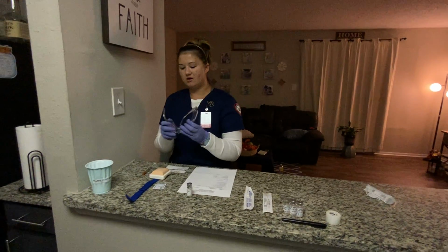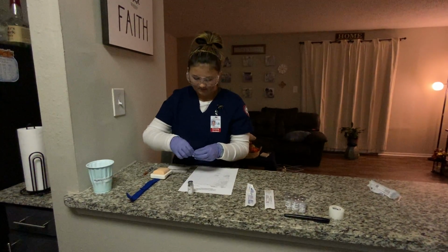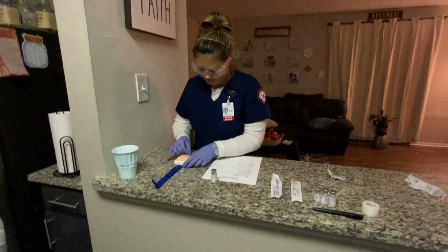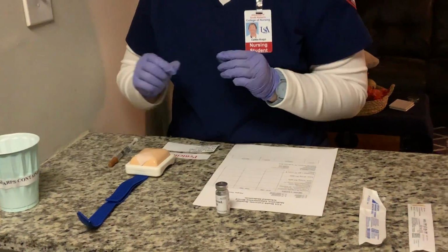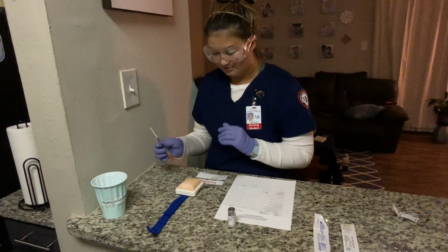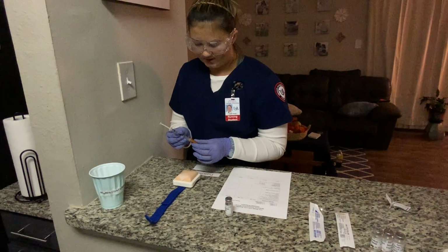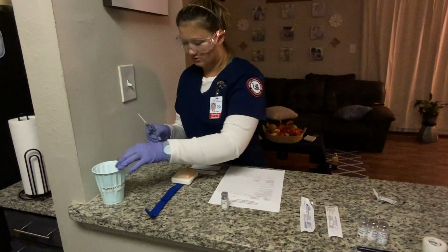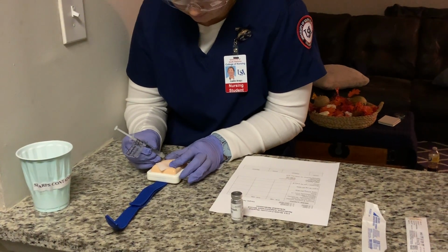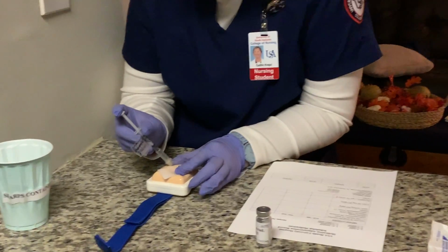So now that I have my gloves and my goggles on, I'm going to clean the injection site with an alcohol pad from the innermost area to the outermost area. And I'm going to leave the alcohol pad pointed to just about where I need to inject. So now that I have it cleaned and I have explained where I'm going to be giving it and why and what exactly I'm going to be doing, I'm going to take my cap off and I'm going to pinch 1 inch of skin, and I'm going to be inserting it at a 45-degree angle, and I'm going to insert the medication slowly.